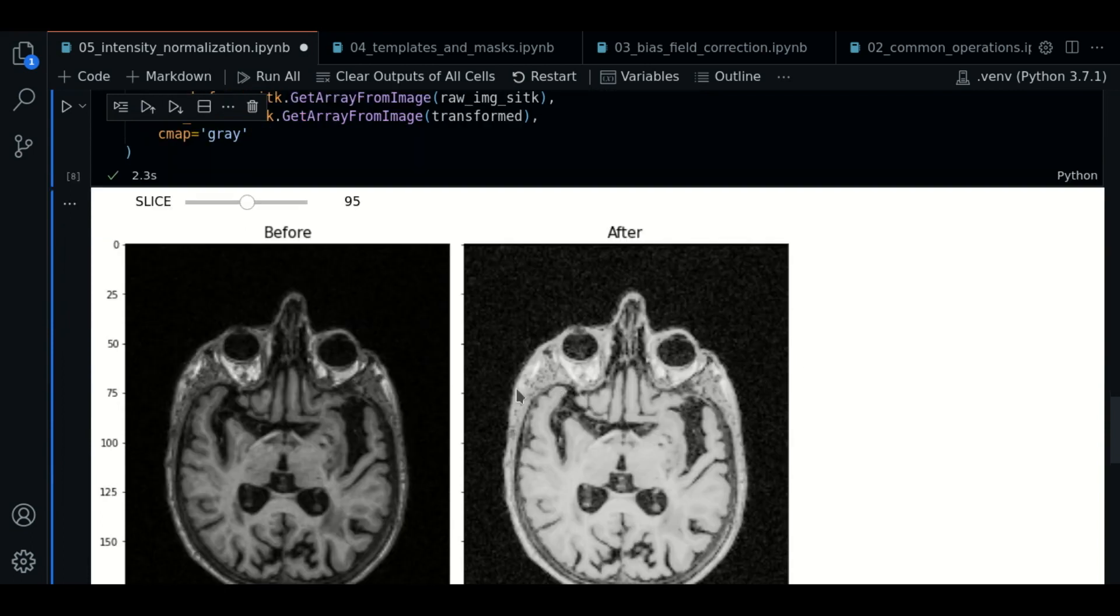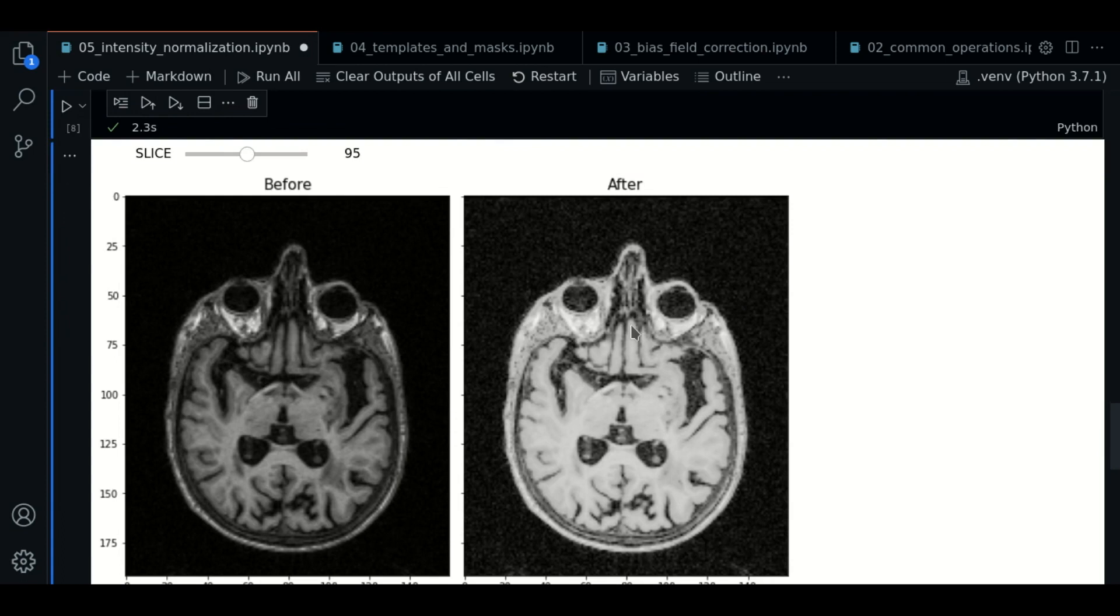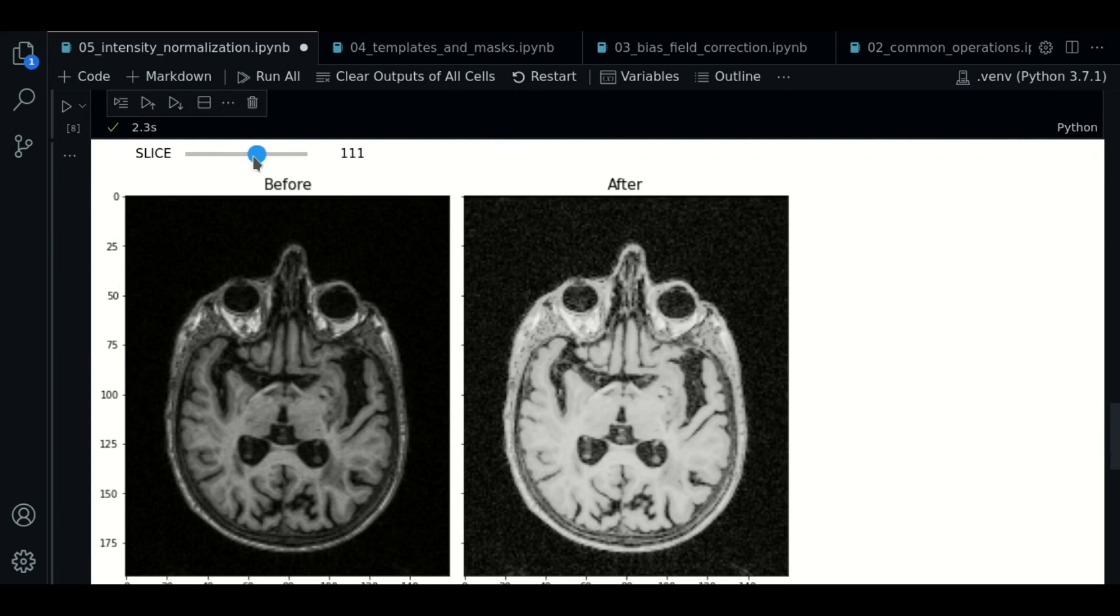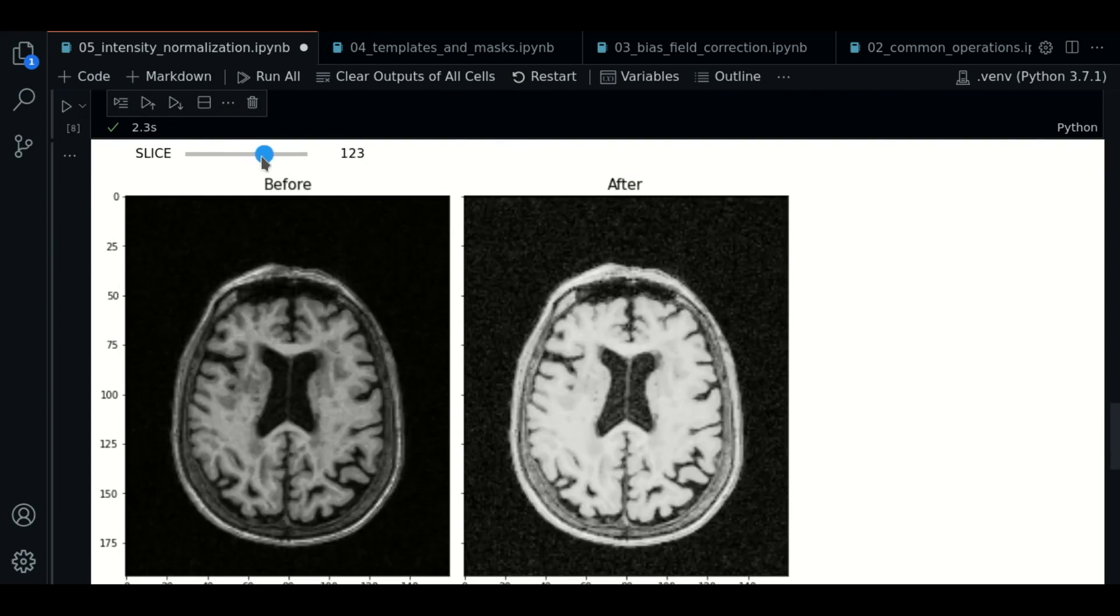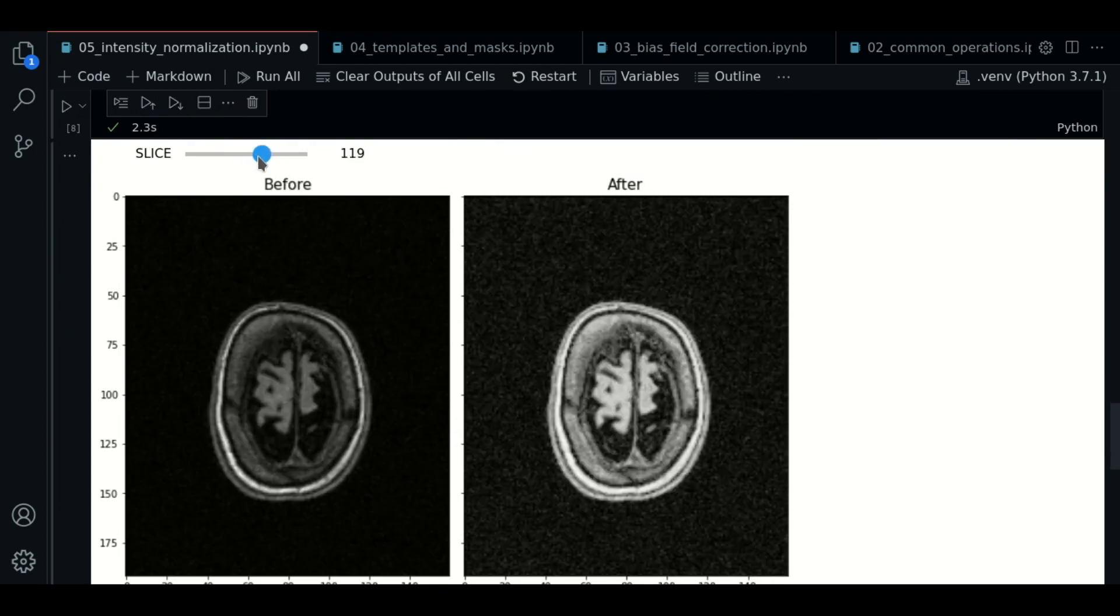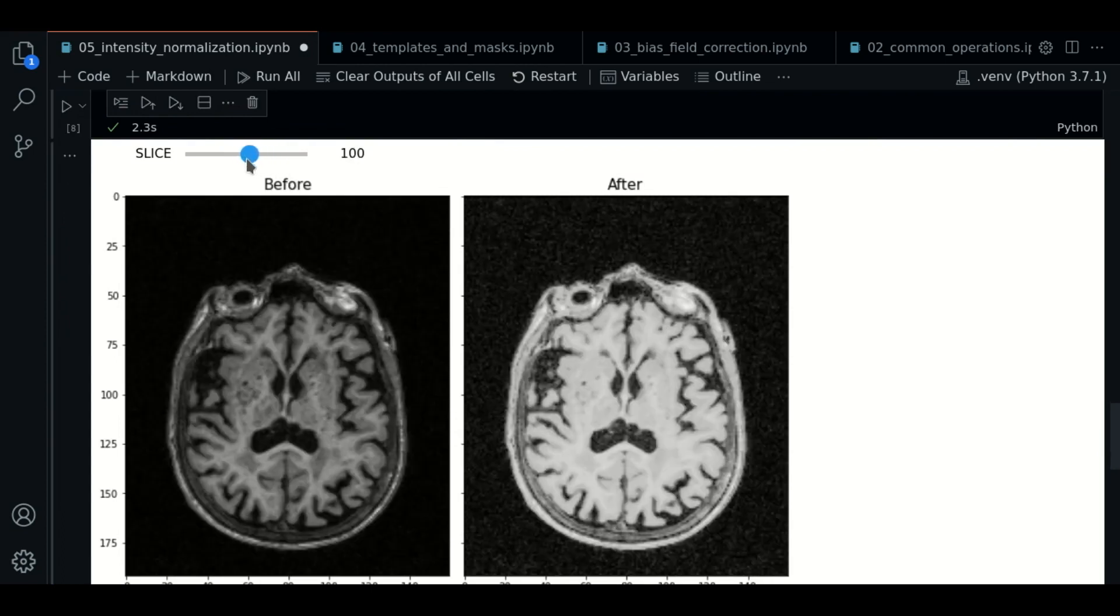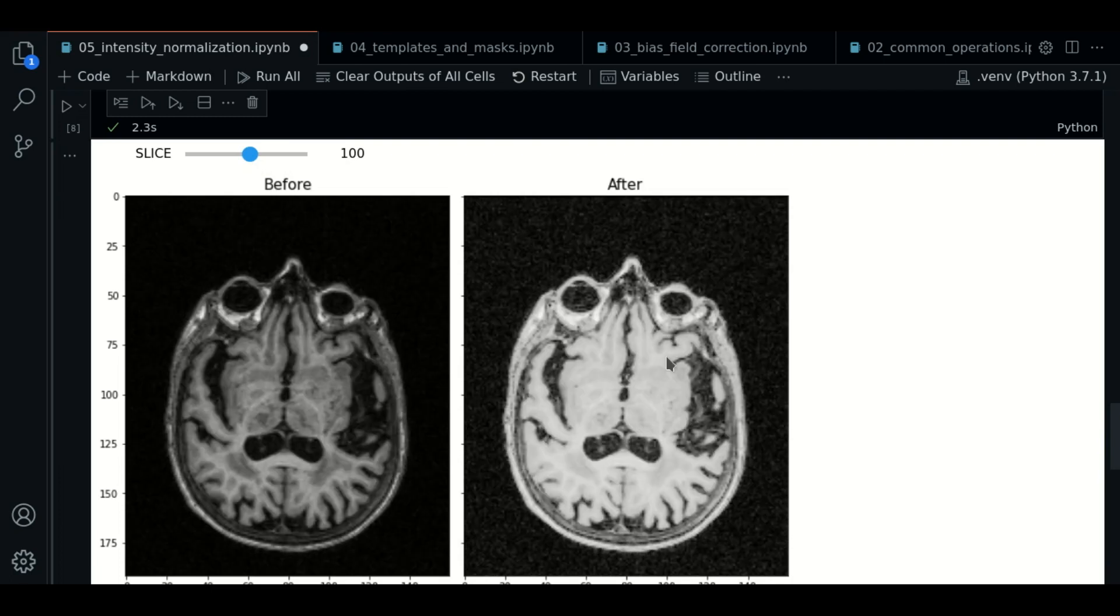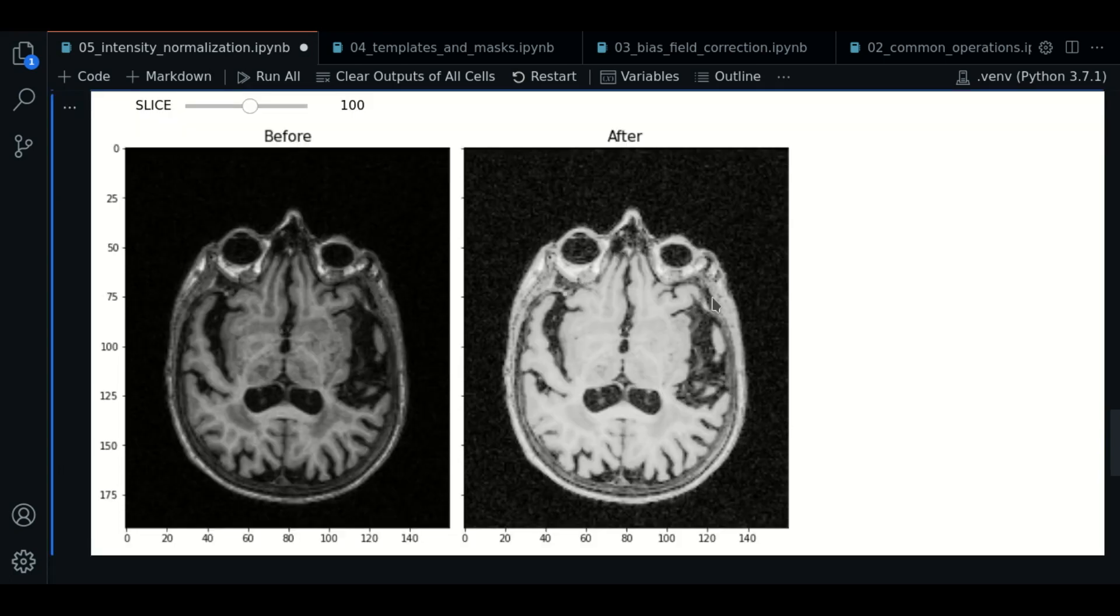now the intensity values have changed. This is the result of adjusting the distribution of the intensities to the template image.